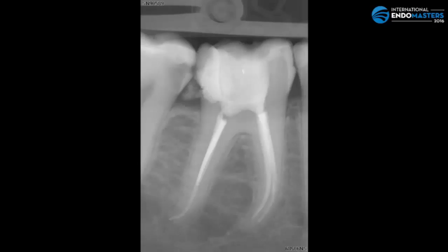This is another view of that distal canal, so you can see how the real anatomy is maintained after the preparation using TF adaptive. This is the final result. You can see the obturation in the distal and the mesials too. So I was very satisfied with the final result of this treatment.